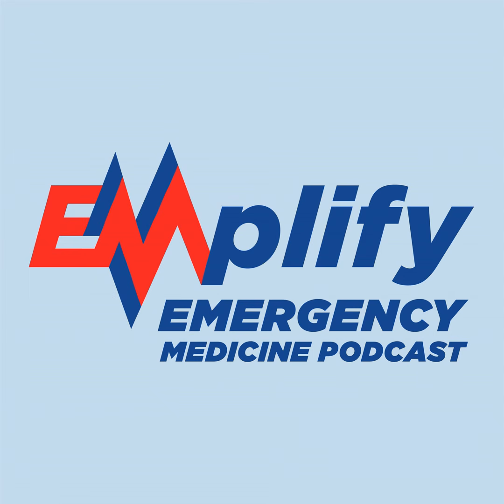You'd like to avoid that if possible, because when you intubate these people who have an uncompensated respiratory acidosis, like people with asthma or COPD who get intubated, every fiber in their body is telling them to breathe. Their CO2 is 90, their CO2 is 100 maybe, and their medullary chemoreceptors are saying, you really need to breathe much faster. Your pH is 7.1, your pH is 7.2, and this is not good, so breathe really, really fast. And they're also likely very uncomfortable, which is also likely going to trigger additional patient initiated breaths.